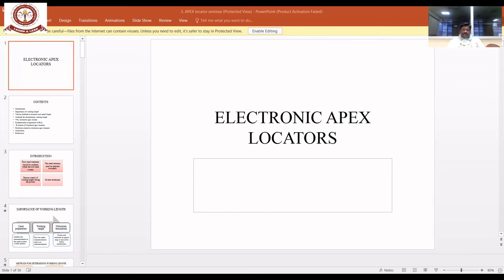Conclusion. No individual technique is truly satisfactory in determining endodontic working length. The cemento-dentinal junction is a practical and anatomic termination point for the preparation and obturation of the root canal, and this cannot be determined radiographically. Modern electronic apex locators can determine this position with accuracy of greater than 90%, but still have some limitations. Knowledge of apical anatomy, prudent use of radiographs, and correct use of the electronic apex locator will assist practitioners to achieve predictable results.